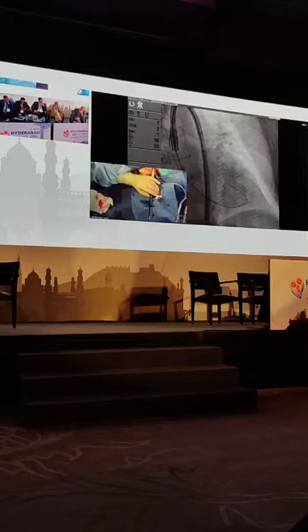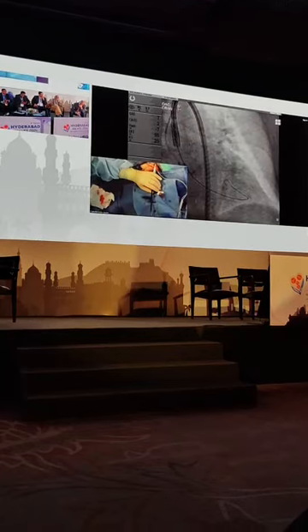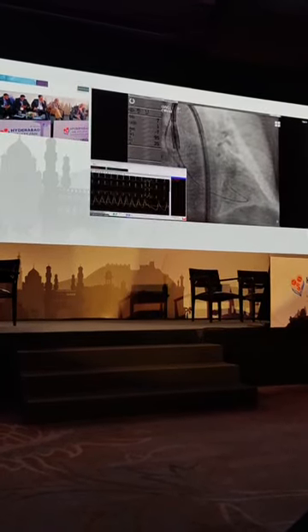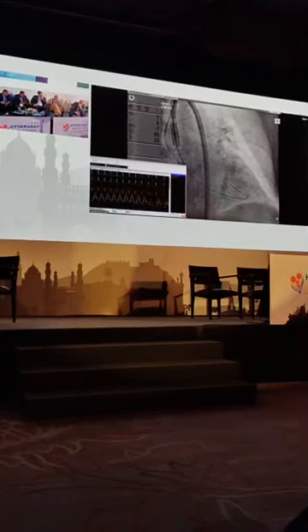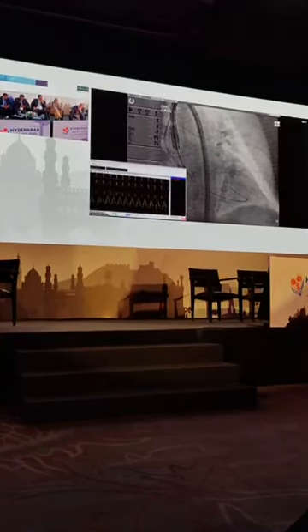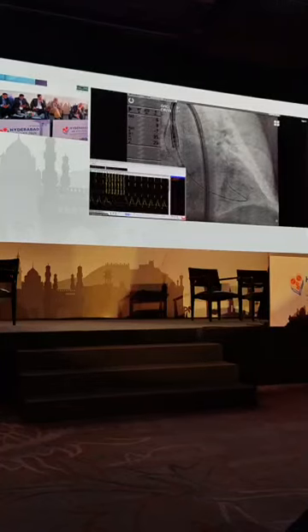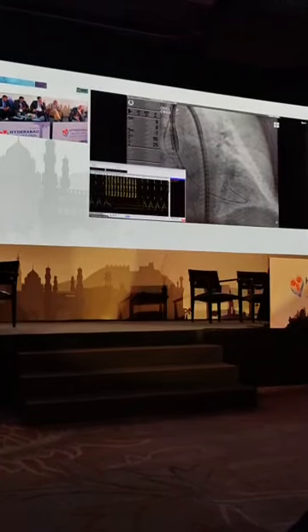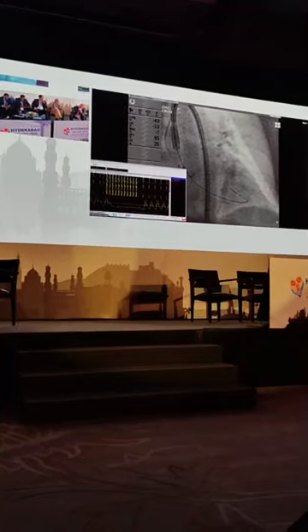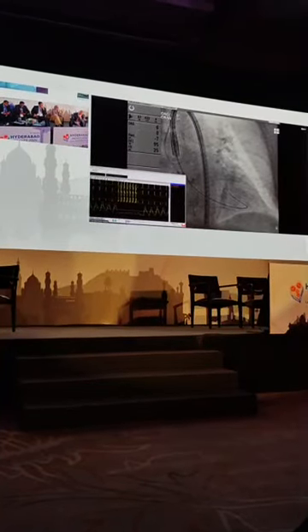Of course, we check the pacing, so we can check it now. Est-ce qu'on peut montrer l'électro, s'il vous plaît? And I will ask the nurse to do the pacing at 180. Vas-y. Stop. You see the pacing works very well. It's immediate and the recovery is immediate. So this is what is important.